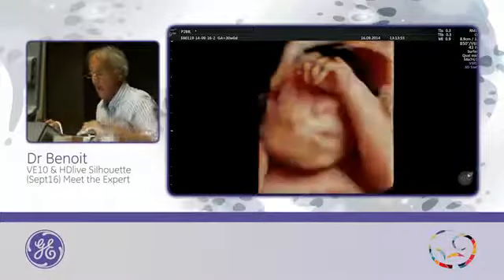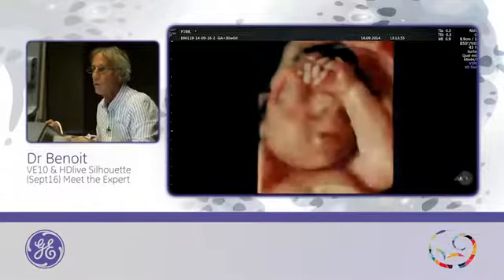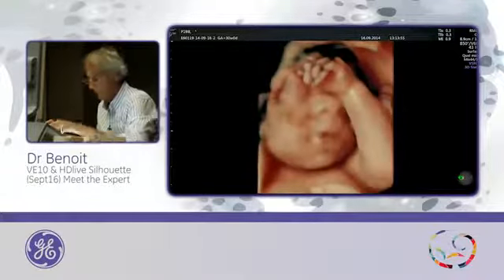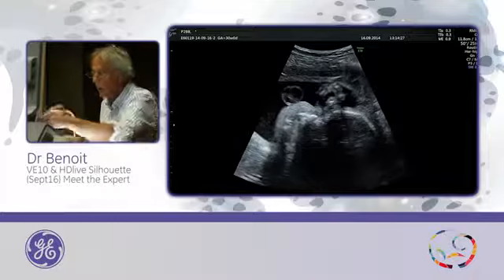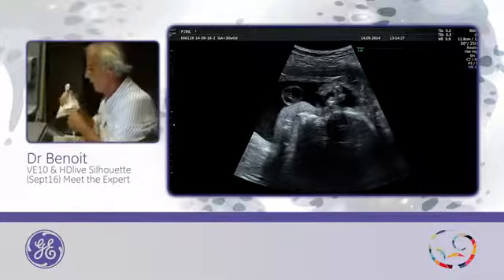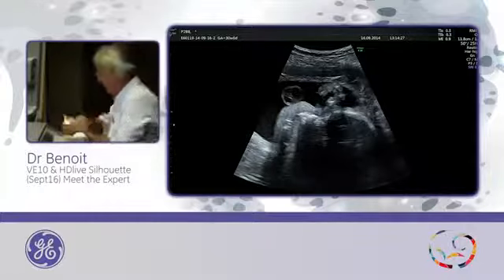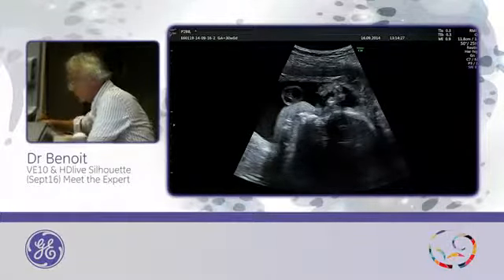And HDlive, or this one, move the position of the light. And it's okay. So now I will open some cases. We can thank this baby because he was a perfect baby. Thank you.